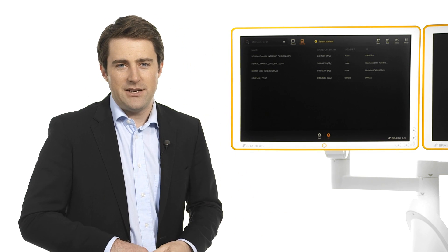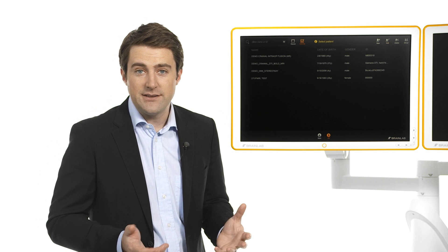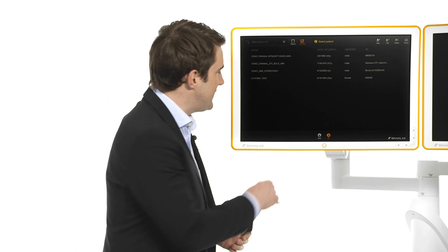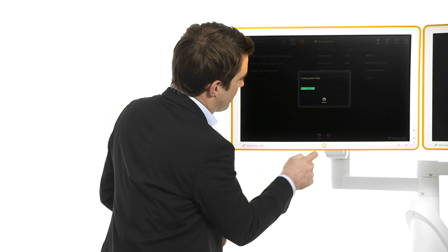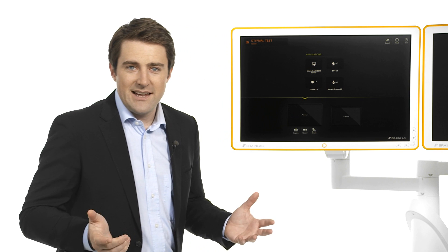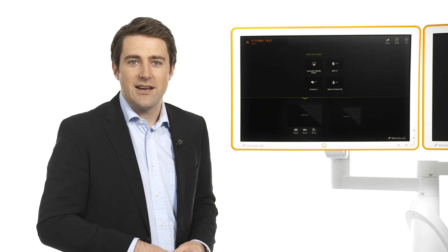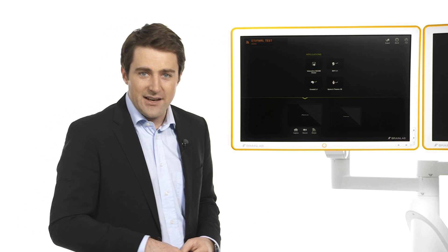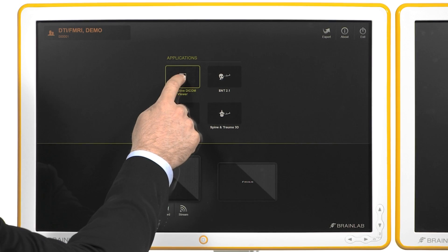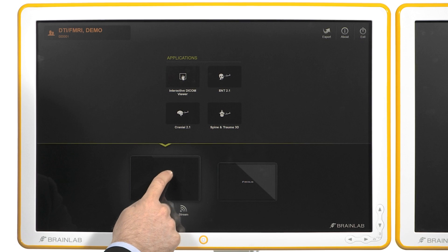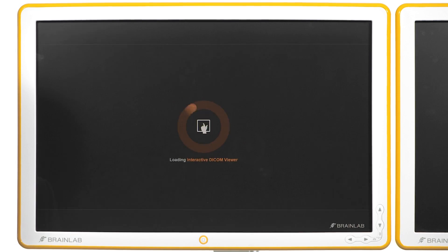I can select a patient from the PACS system, a USB stick, or a CD. After selecting the patient I can choose the desired application such as the DICOM viewer, which displays all available data sets.